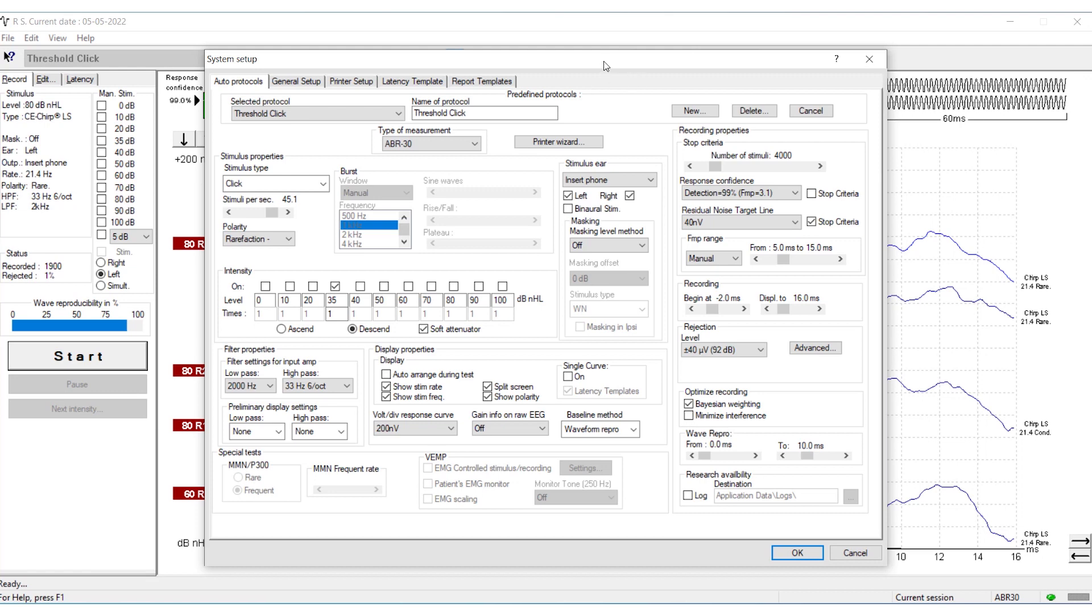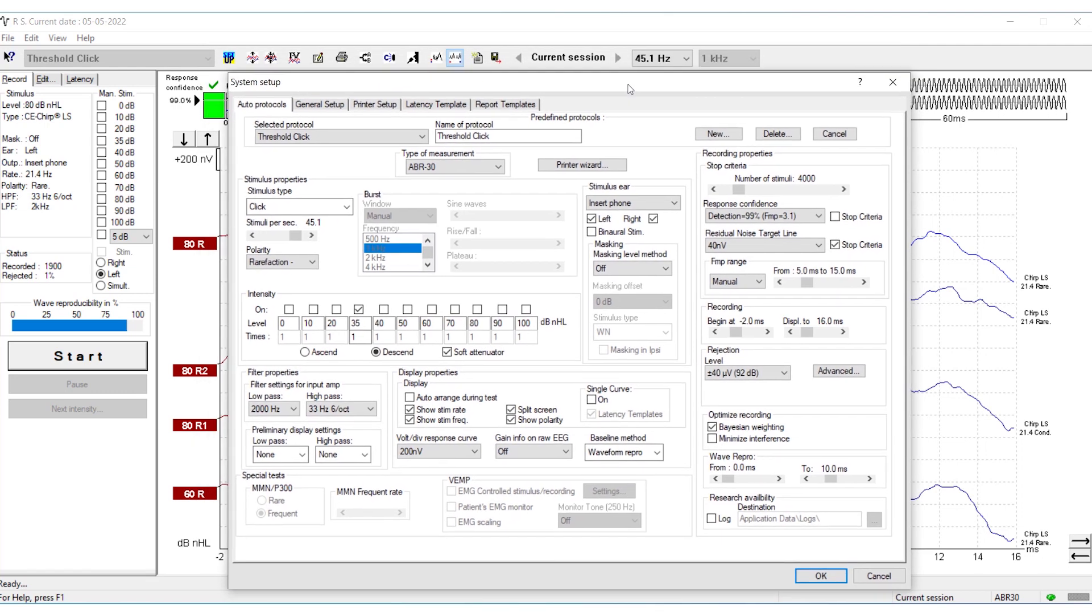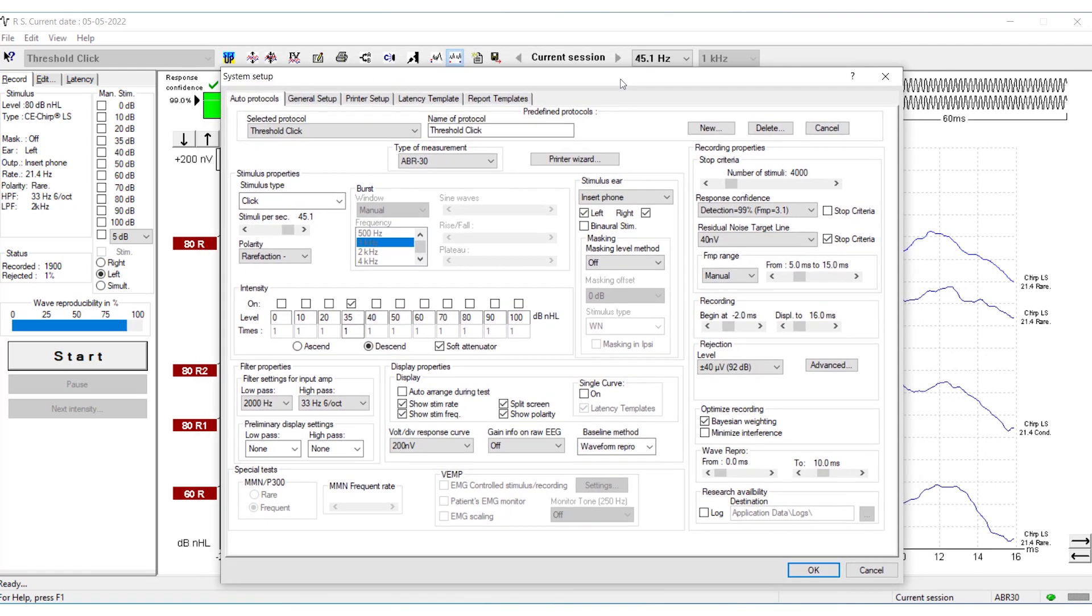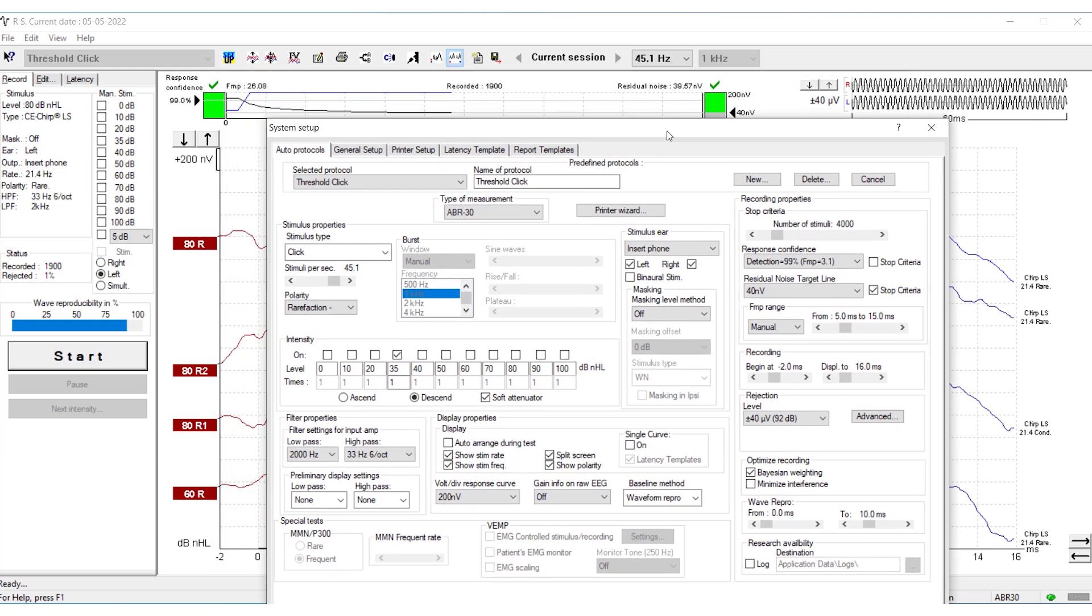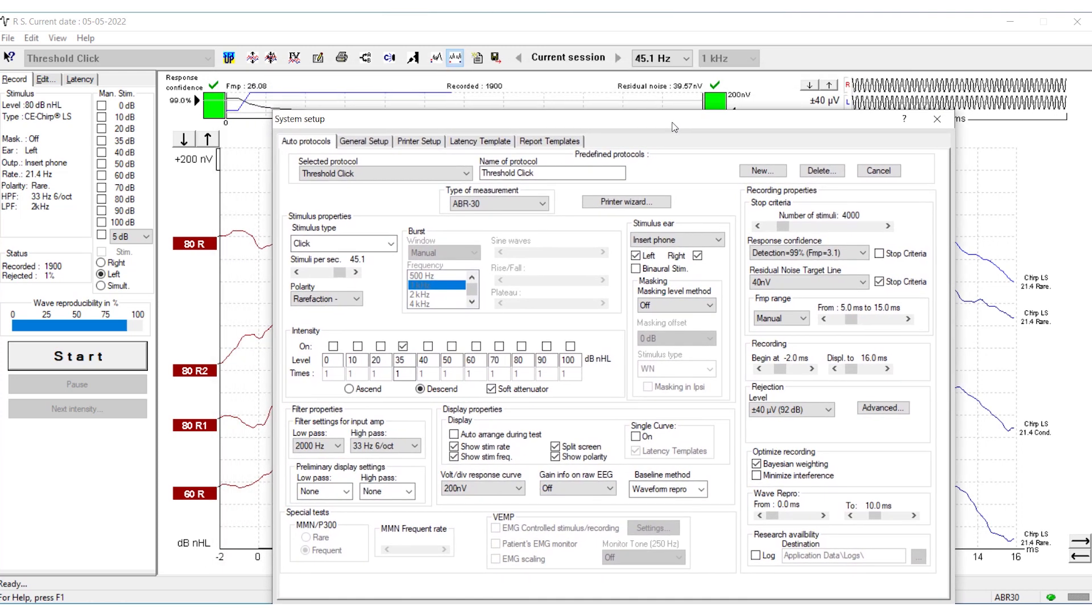Then you are in the System Setup. Here you can make permanent changes to a test protocol, which will affect any future recordings that use this protocol.